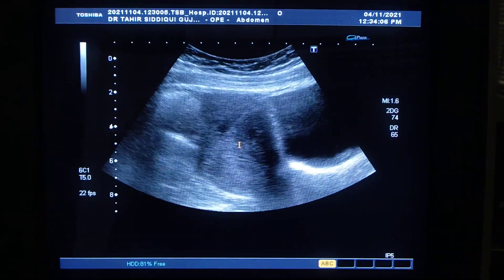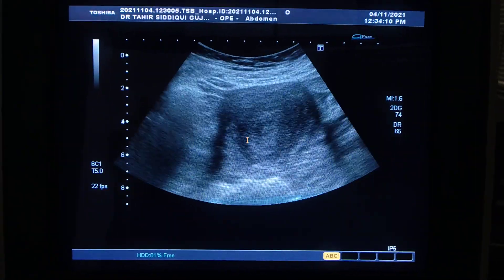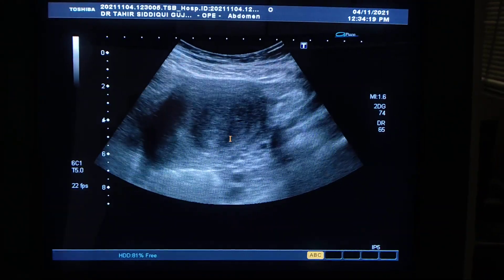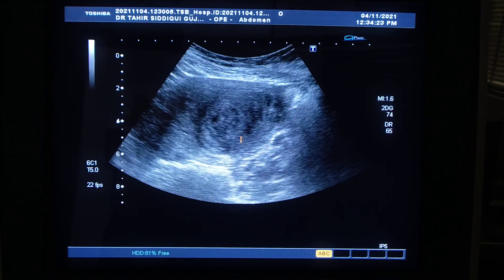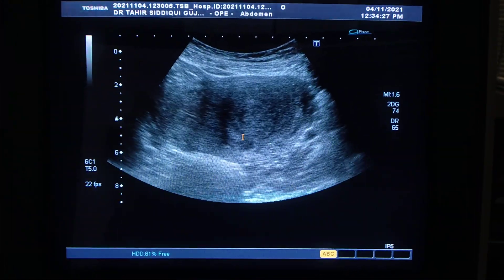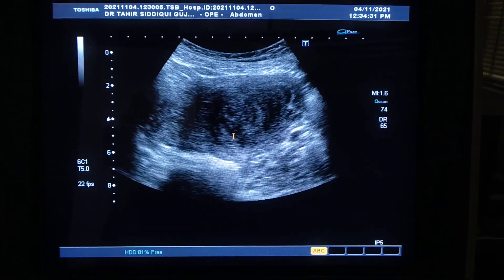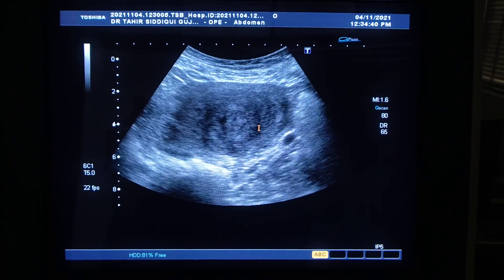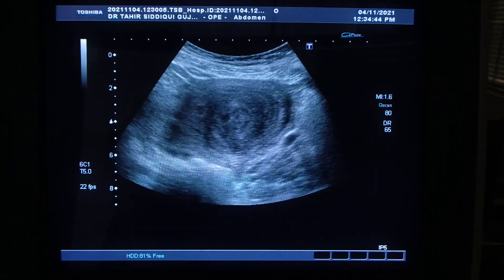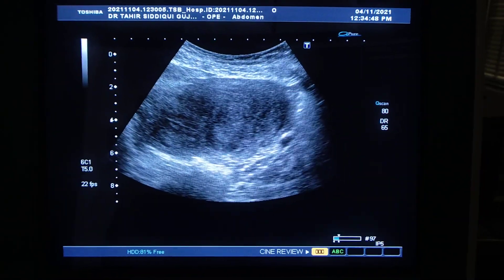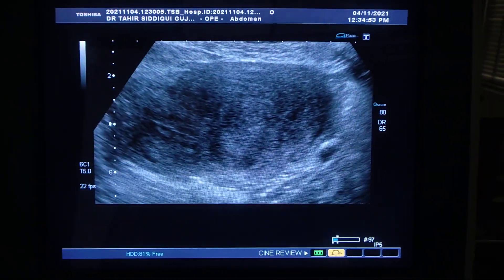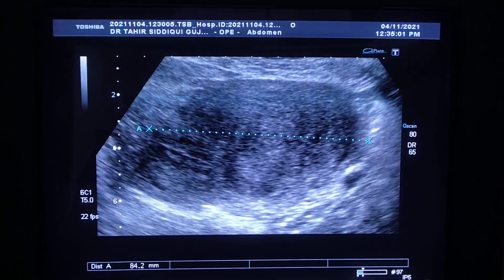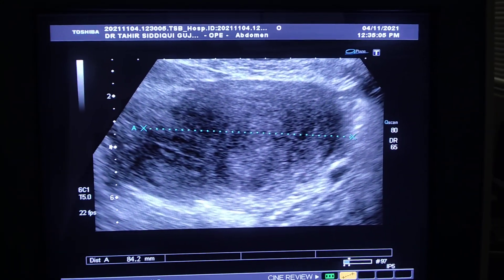This is the longitudinal section of the uterus. Now as I move the probe transversely to get the transverse section of the uterus, you can see the width is too much — it's wide. The width measures 8.4 cm, which is too much; the transverse section should not be more than 5 cm. This is about 8.5 cm.